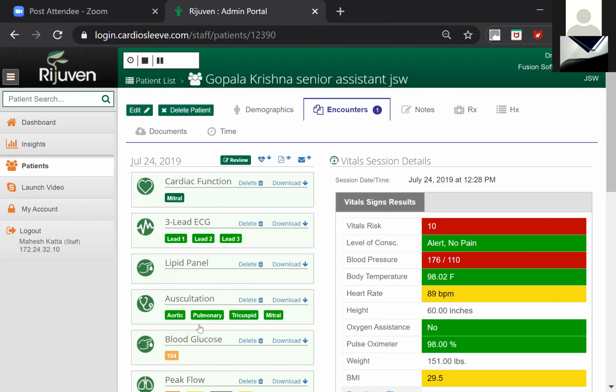Is there a way of adding up, if there is the need to add up some queries somewhere on the device? Is it that robust to add up, or what you give us is what we have? No, we can add. Most of the things, once you go through this, we are covering most of the stuff. But still, if we need to add something at the application level, we can add. No, that's not a problem.